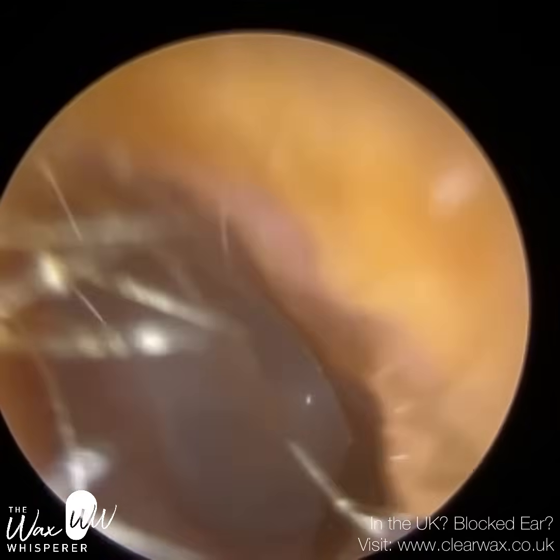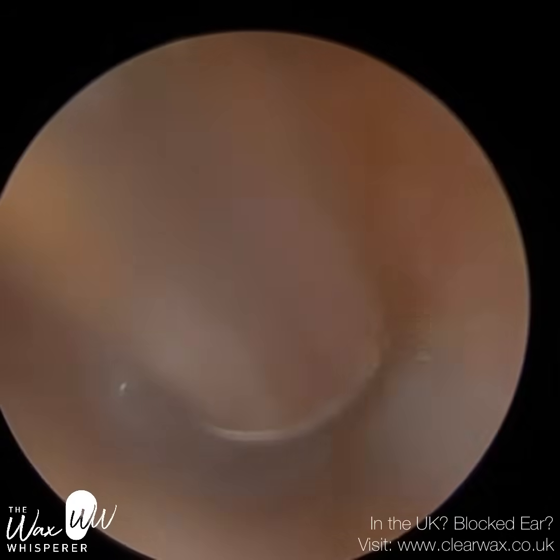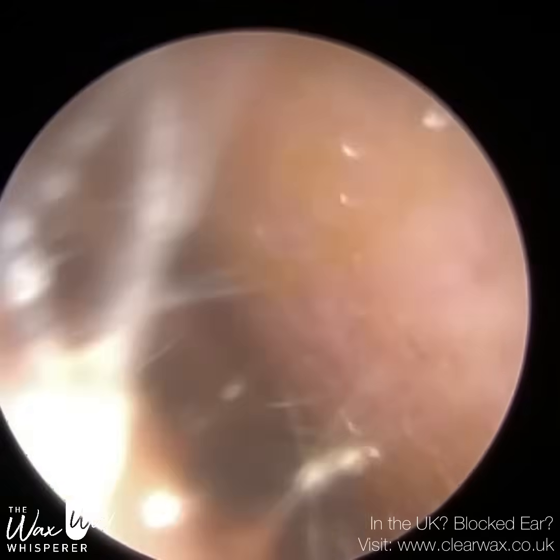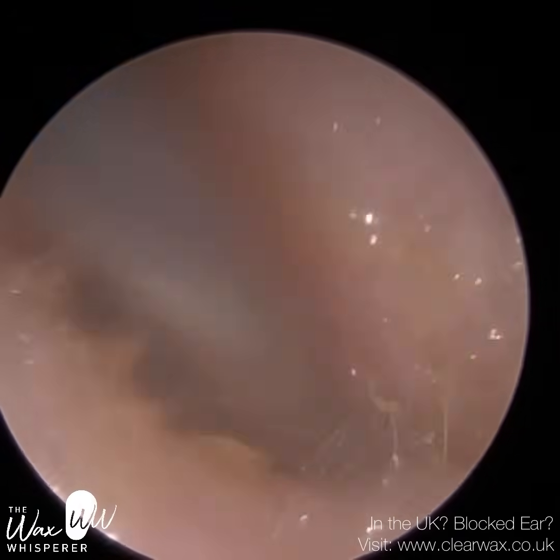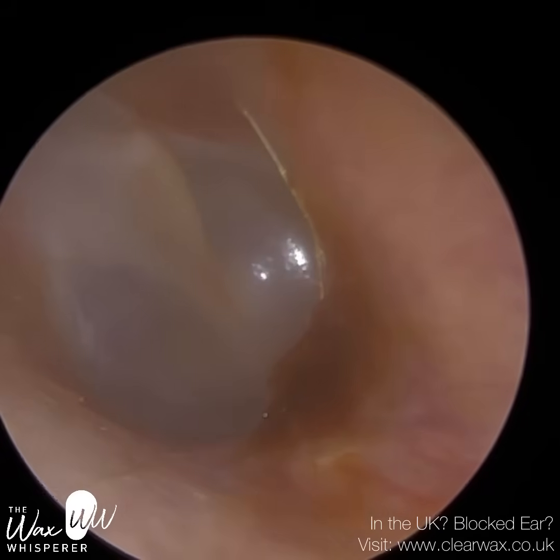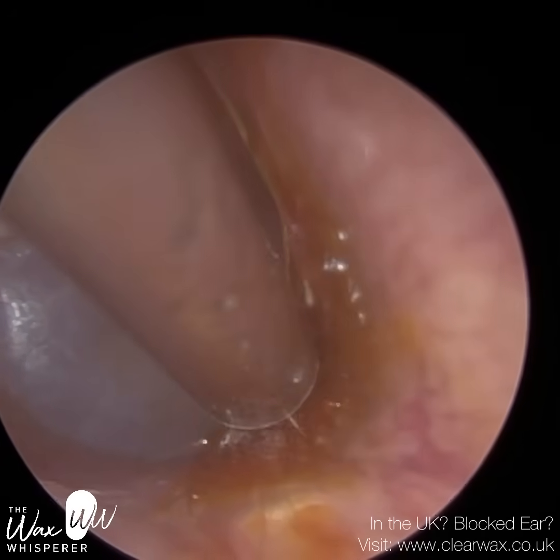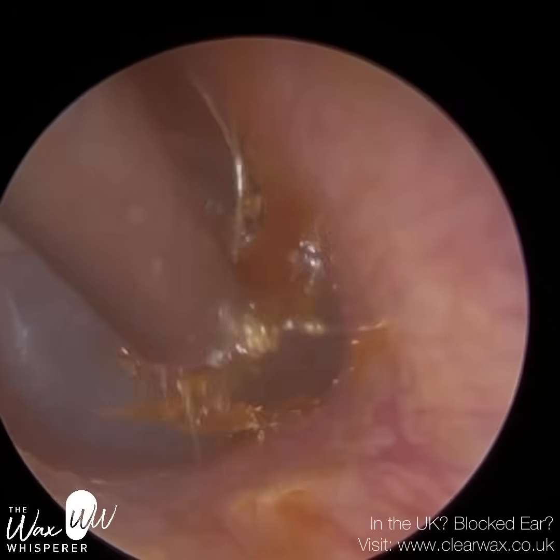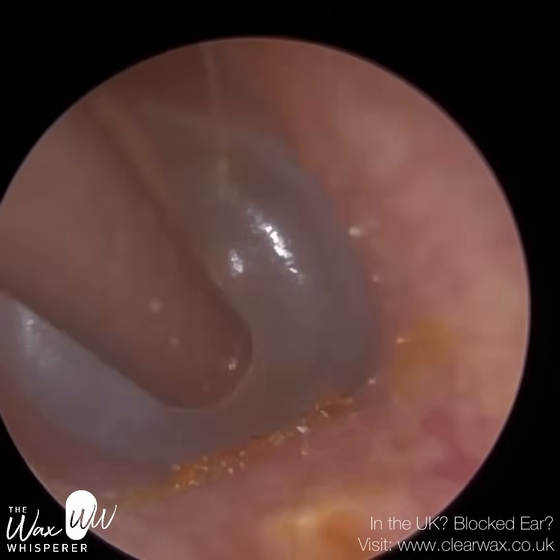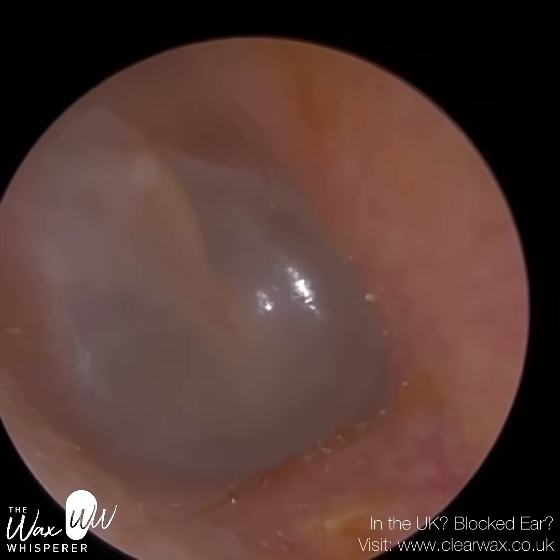There's just a bit of dry wax at the base of the ear canal, very deep in the ear. I'm just going to use a fine end suction probe to see if I can hover over this. There's some skin in the way — I'm going to remove that first. I'm going to give the lens a good wipe in a moment because it's got oil smeared on it. I'm just going to hover over it — if it comes away, great; if not, I'm not going to spend too much time. I'm not going to lose any sleep over leaving this bit of wax. It's not coming away and I don't want to touch or scrape the canal wall, so I'm just going to leave that. Nice, healthy eardrum.